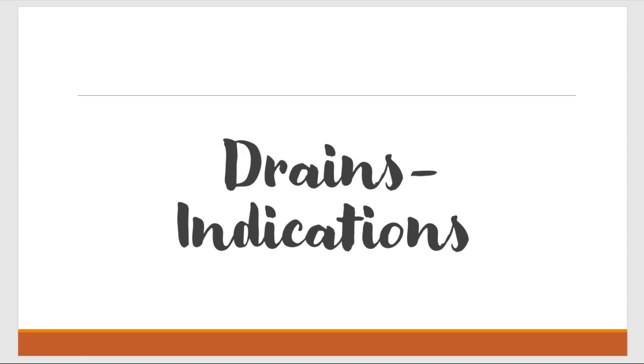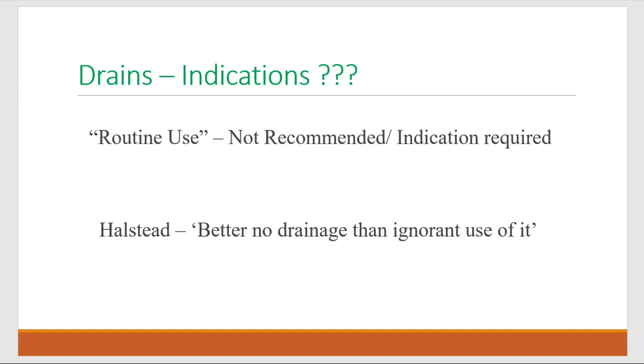So, okay, now we know what is a drain, but where to use it? What is the use of these drains? For that, a few indications are there. An important thing is we must know that routine use, meaning I have operated some patient and whether required or not, I am putting a drain, is usually not recommended nowadays.